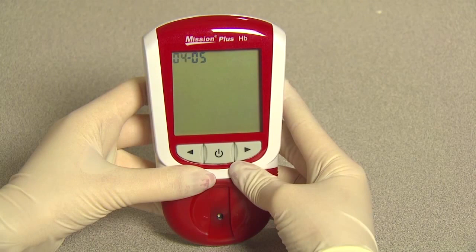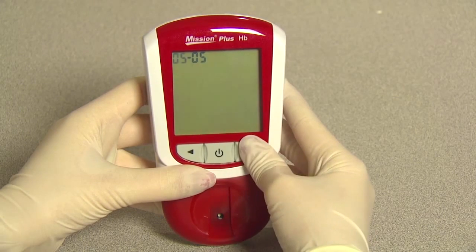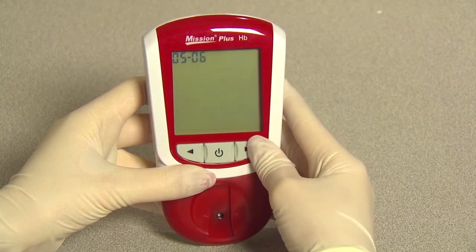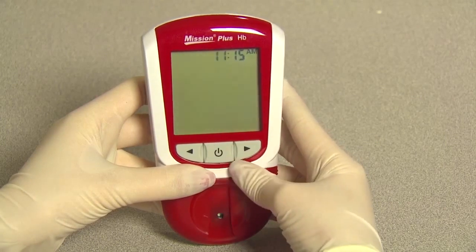The month and date will appear at the top of the display. They will be separated by a single dash with flashing month. Press right or left until the correct month is displayed. Press power button to save. The day will flash. Press right or left until the correct day is displayed. Then press the power button to save and proceed to time setup.